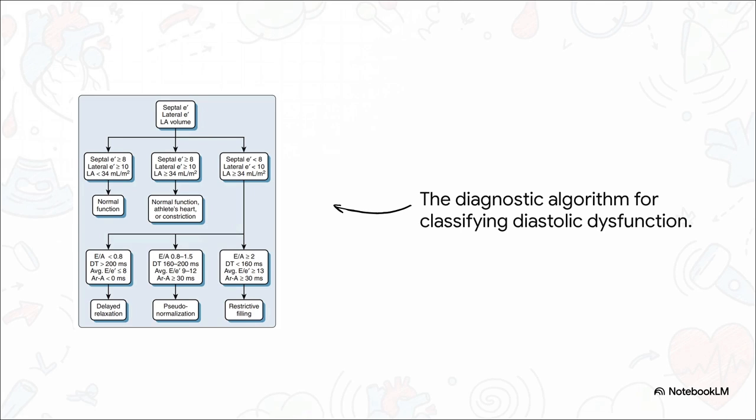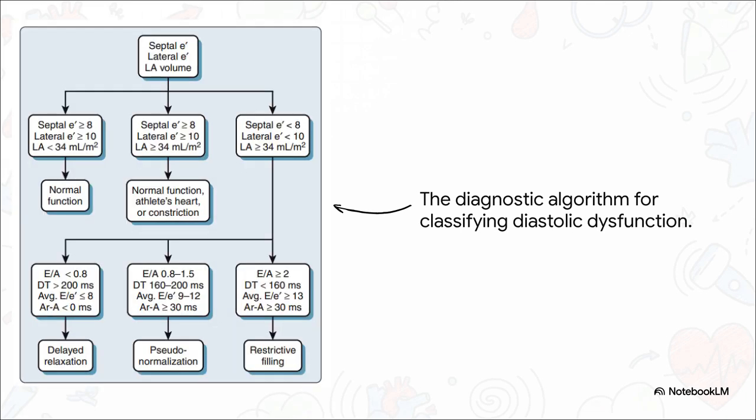Okay, here it is, the complete algorithm for classifying diastolic dysfunction. Now, I know this looks like a lot on one slide, but don't worry. We're going to break it down piece by piece. Think of this as your decision-making roadmap.